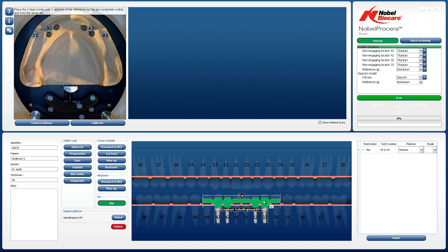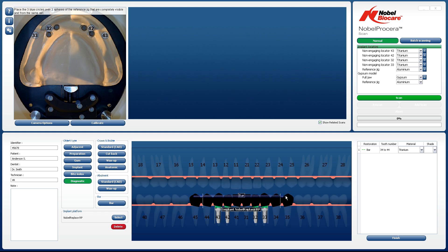Once the bar has been placed on the tooth chart, the next step is to establish the diagnostic scan. Left-click on Diagnostic under Object Type. Left-click on the most posterior tooth in the quadrant that corresponds with the diagnostic. While holding the left mouse button down, drag the diagnostic through to the most distal tooth in the other quadrant. Releasing the left mouse button at this point will place a diagnostic in the tooth chart over the top of the bar.